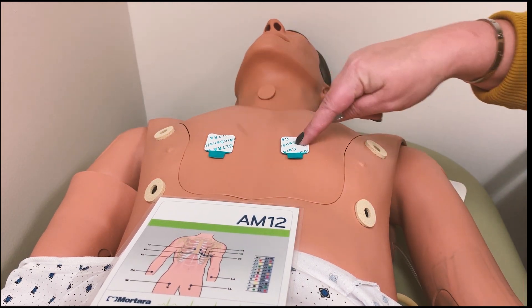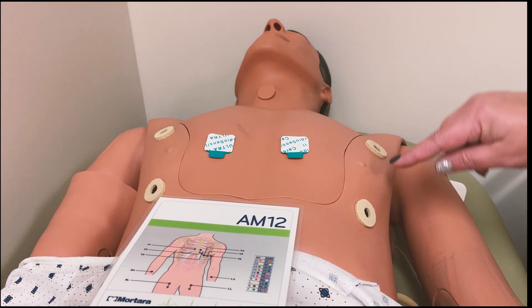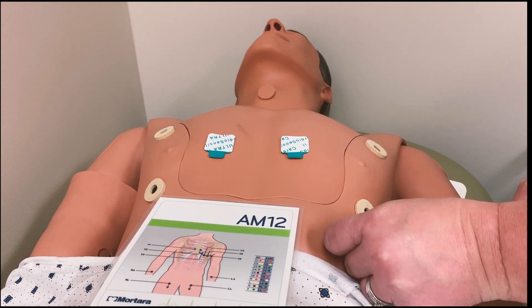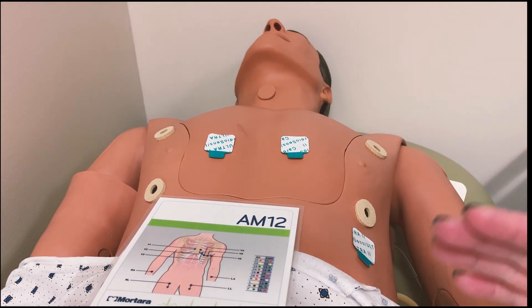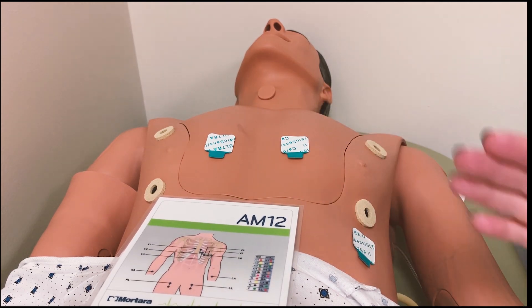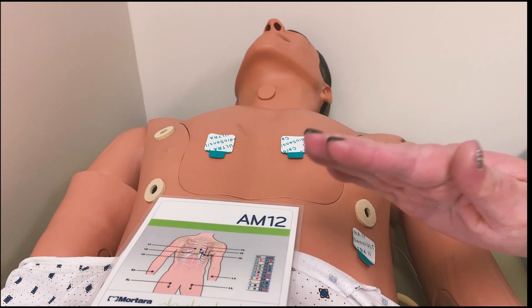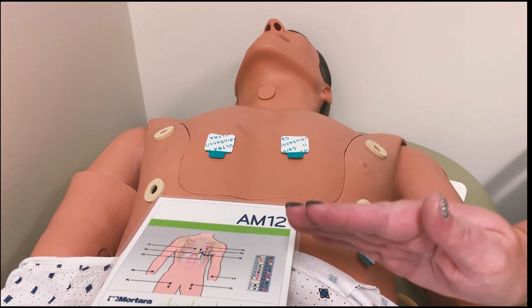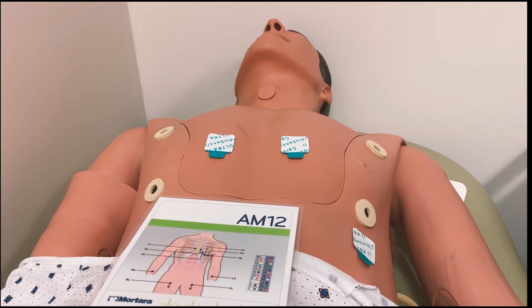For leads one and two, I skip three, do four, and usually go mid-nipple line down somewhere a little bit below the breast. Now, if you have a large-breasted woman, you may need to move the breast tissue up. If that is the case, never cup and move. Take the back of your hand in a very clinical manner and just lift the breast tissue, place the lead down, lay the breast tissue back down, and remove your hand. Never cup with your hand, as that could be misread as another type of touching.